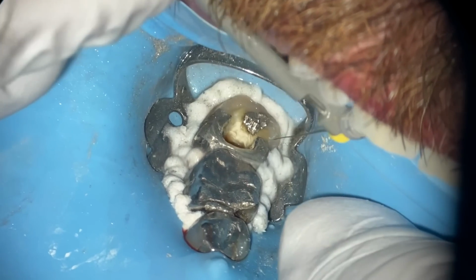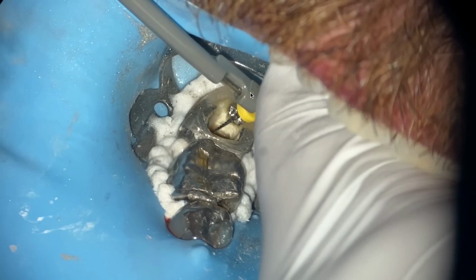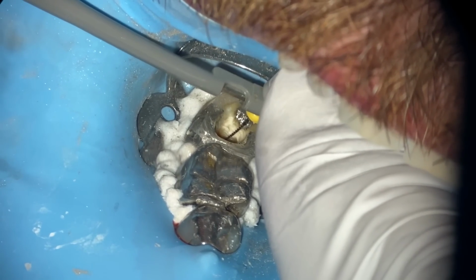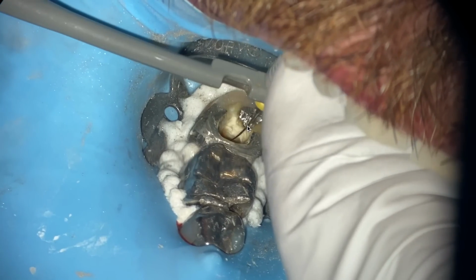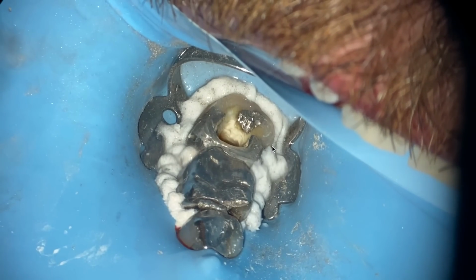And one of the things you can do, watch what I'm going to do, is I'm actually going to use the file holder to help me place that file into the different canals. Now it looks like I'm into that mesial buccal or potentially distal buccal. I think so. I'm aimed into the distal buccal now, and I'm feeling around using the tactile sense if that's an easy drop to the apical portion. Let's take a look. Do I need to watch wind it?